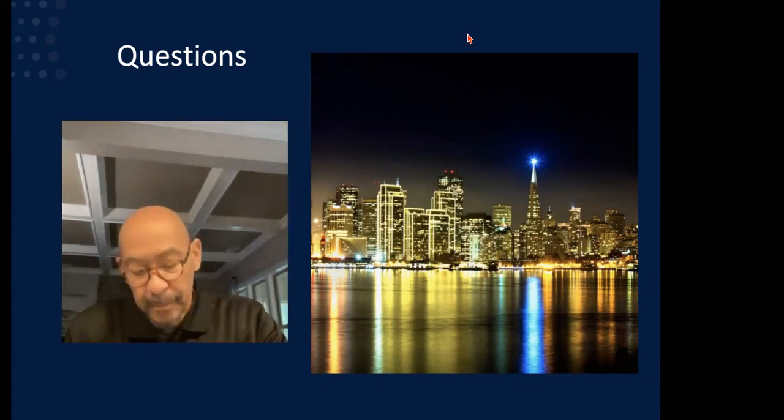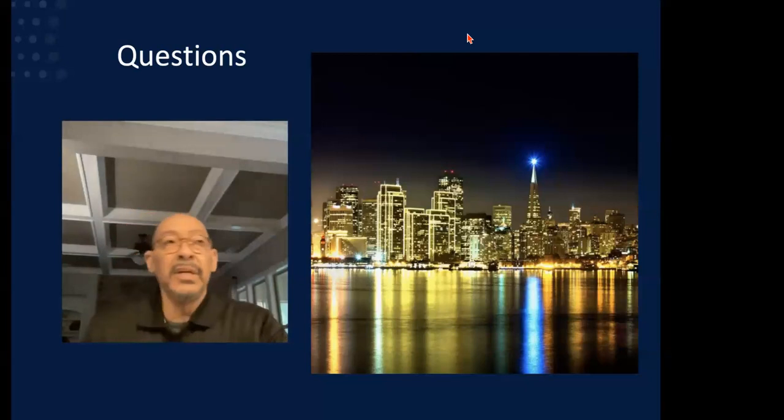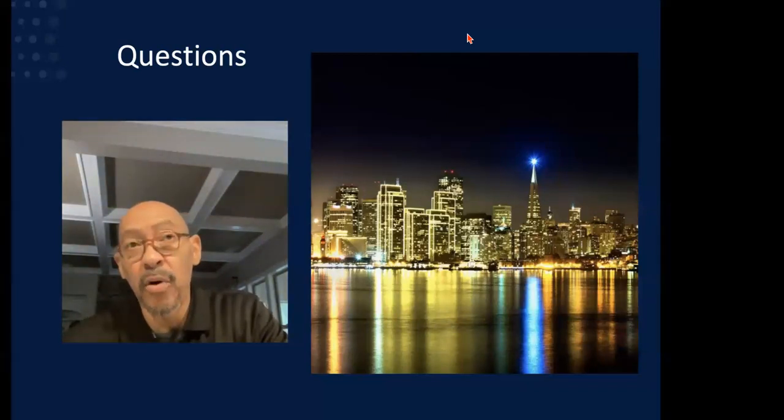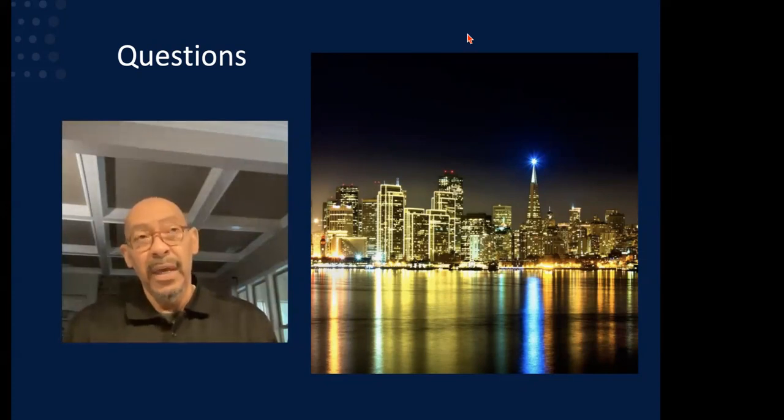Here's another one from Jeremy. Which aspects of the lens do you expect to alter and or refine during the clinical trials? So during the clinical trials, there are a lot of things that we'll be looking at, but two things in particular. One is we want to be able to make sure the patient can resolve with their distance vision. We want them to be able to see extremely well in the distance. So it's a performance standard that we want to make sure that we can hit. Where you make the changes and mitigations to performance is through your calculations. So we'll look at how to do a proper IOL calculation to get that performance standard where it needs to be. The other thing is your curves.